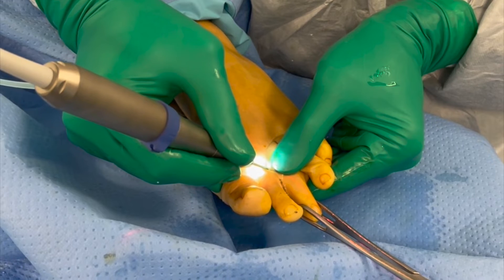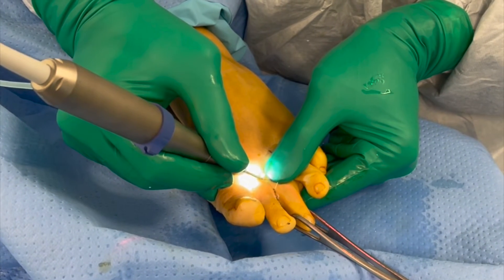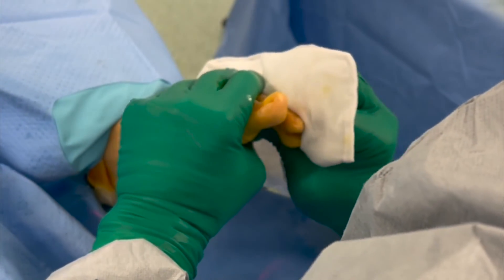It is important to manage the incision during this procedure to avoid iatrogenic damage from the burr. The incision can be manipulated with the thumb and index finger of the other hand to ensure that the burr stays in the centre of the incision at all times.